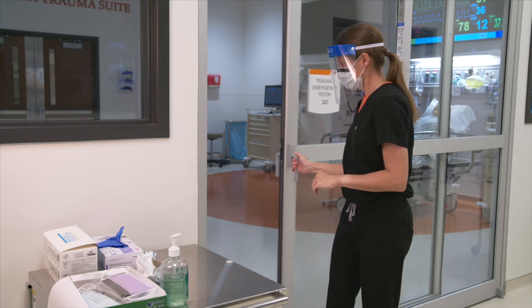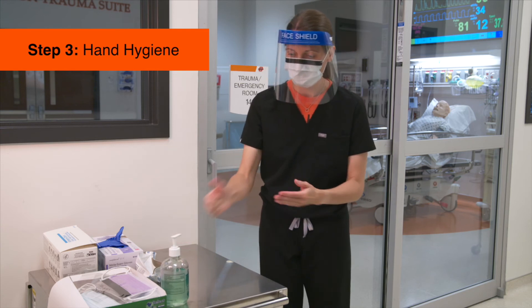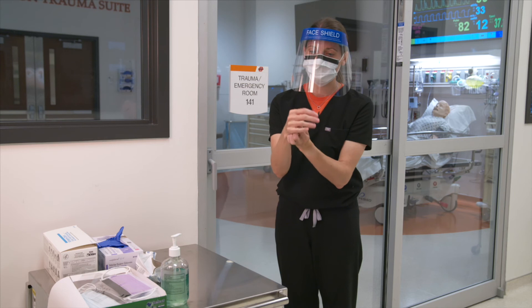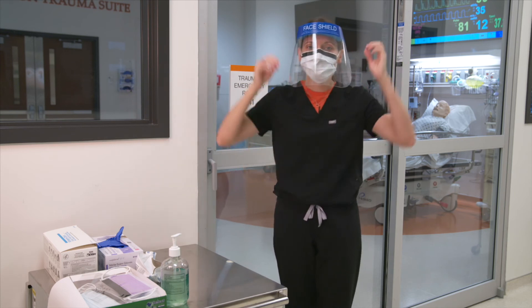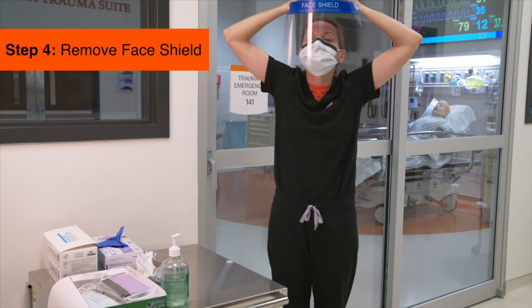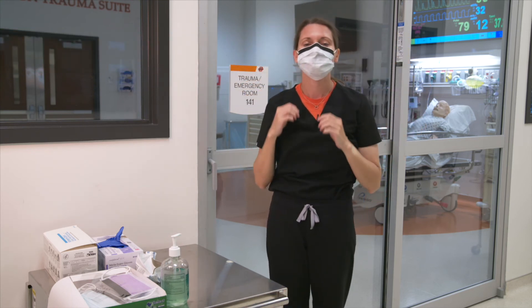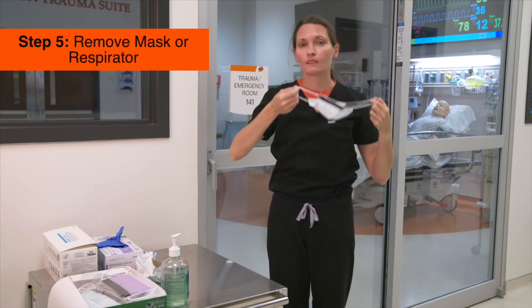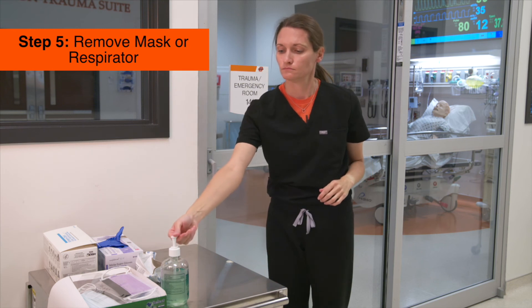After leaving the room, perform hand hygiene by using alcohol-based hand sanitizer or washing your hands with soap and water for at least 20 seconds. Be sure to clean your wrists where the edge of the glove was located. Carefully remove the face shield or goggles by grabbing the strap and pulling upwards and away from your head — do not touch the front of the face shield or goggles. Next, if you are wearing a face mask, carefully untie the straps or unhook them from your ears and pull the mask away from your face without touching the front of the mask.